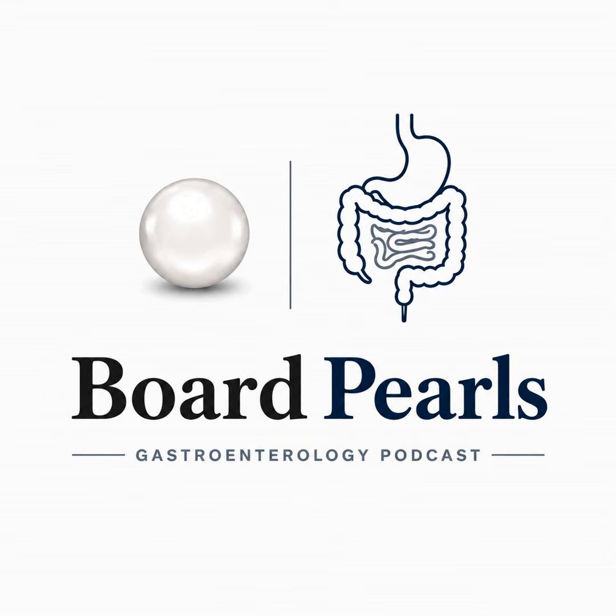Then comes the highest yield test after MRCP, and it is EUS. The reason EUS sits at the top is mechanistic. The recurring identifiable cause that transabdominal ultrasound cannot see is microlithiasis. These are gallbladder stones so small they fall below the resolution of surface imaging, but they are large enough to slip out and intermittently obstruct at the ampulla. EUS gets a transducer right up against the gallbladder and the distal duct, so it resolves what the surface probe cannot. EUS also screens for occult chronic pancreatitis criteria and for a small mass. That is why it outranks everything except the MRCP that precedes it.